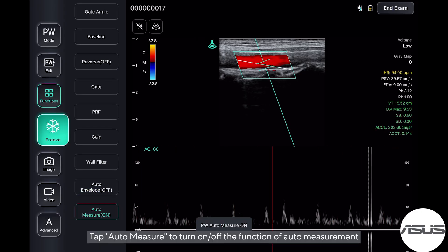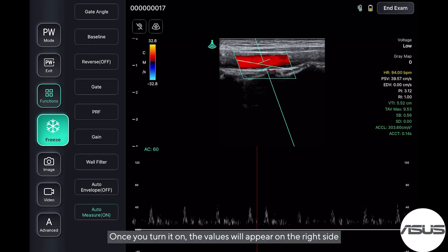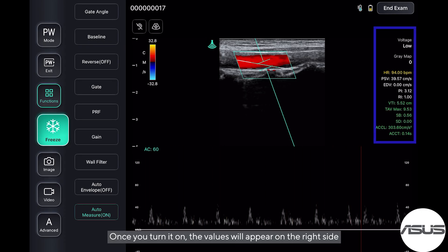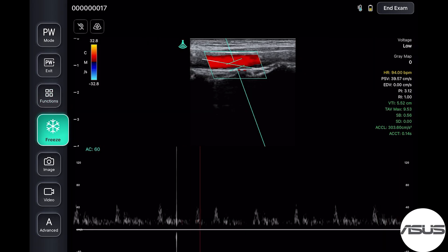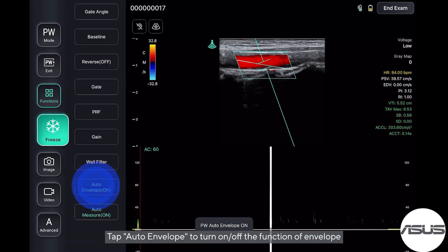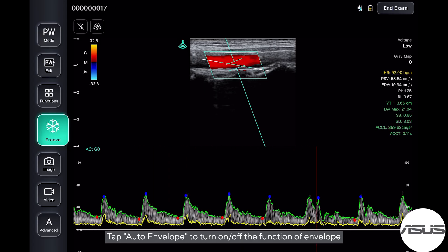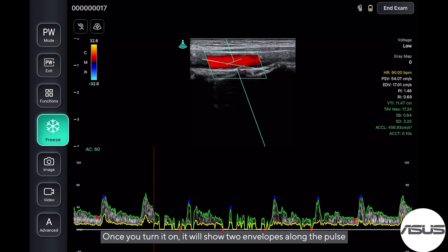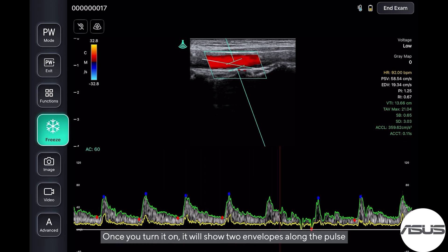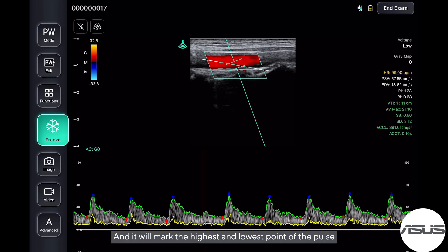Tap gain to adjust the brightness of the bottom image. Tap auto-measure to turn on or off the function of auto-measurement. Once you turn it on, the values will appear on the right side. Tap auto-envelope to turn on or off the envelope function. Once you turn it on, it will show two envelopes along the pulse and mark the highest and lowest points of the pulse.